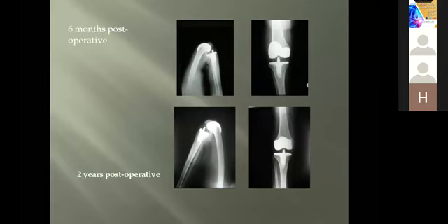This is one of my patients, 6 months post-operative and 2 years post-operative. You have the range. As long as the patient has a good pre-operative range, you can reach this range. But you have to warn your patient, this is not for everyday use. This is not for use 5 times a day. This is to be used when needed, when you need this degree of flexion, such as going in and out of the car, going up from a low chair, and such circumstances.